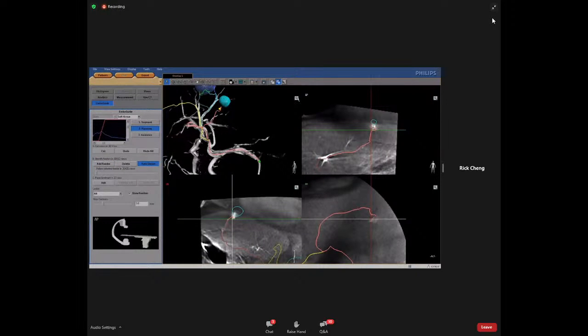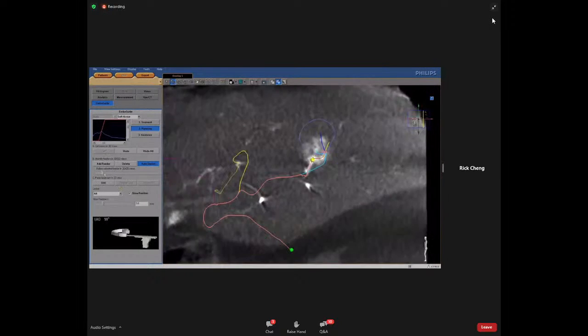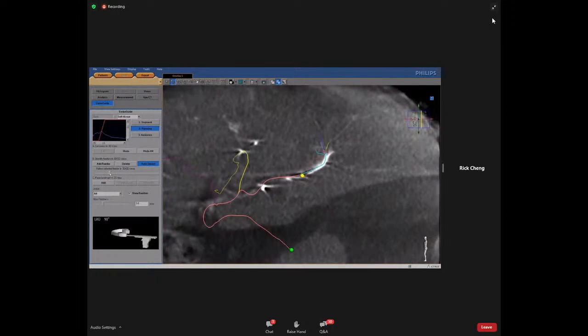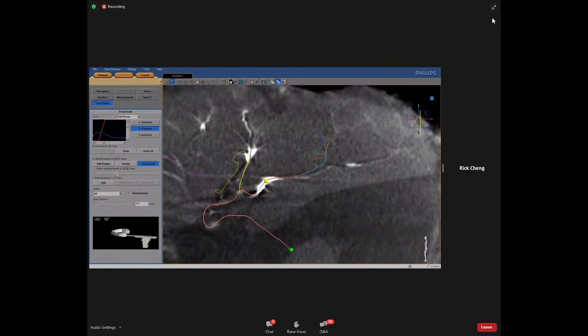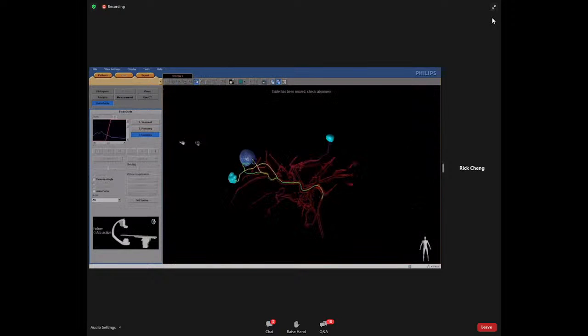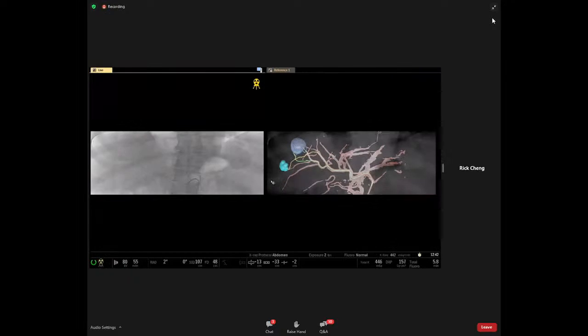Check the result in all planes and see if all feeding vessels follow the correct path with the Follow Selected Feeder slider. Once satisfied with the result, proceed to the guidance step. A 3D roadmap becomes visible on the interventional work spot. In the roadmap, the vessel paths to the tumors are visible.